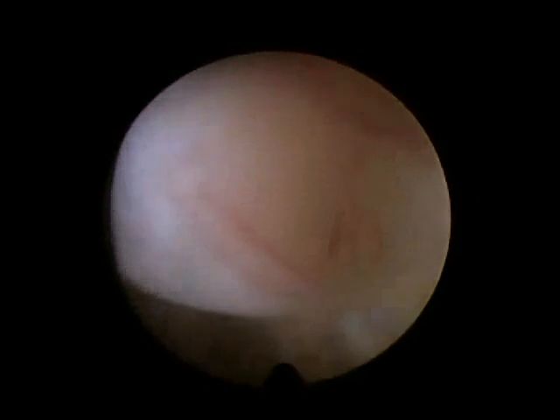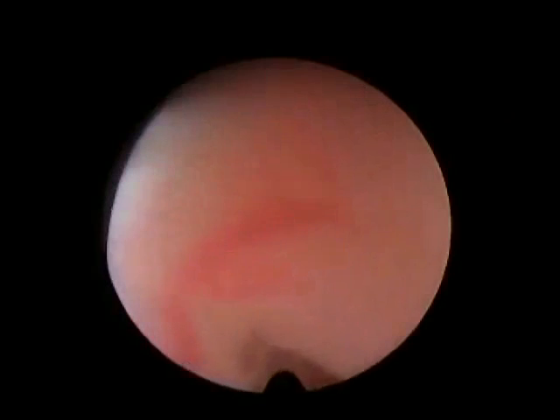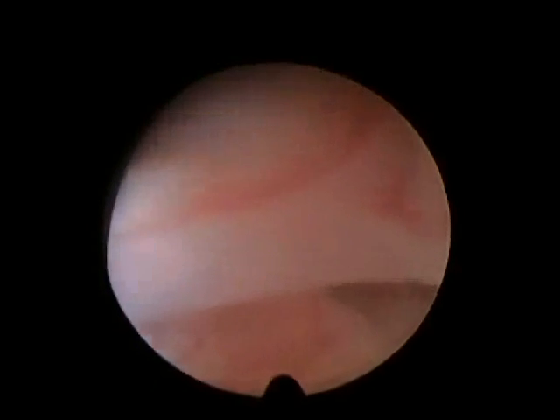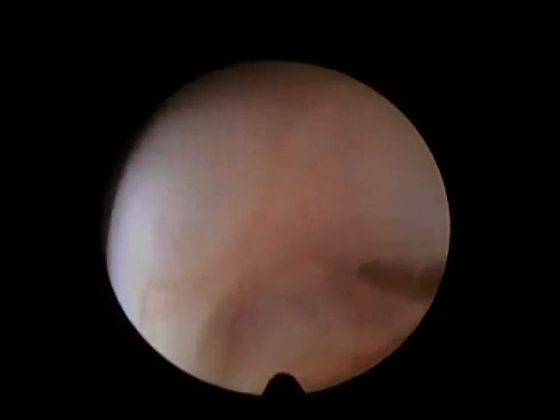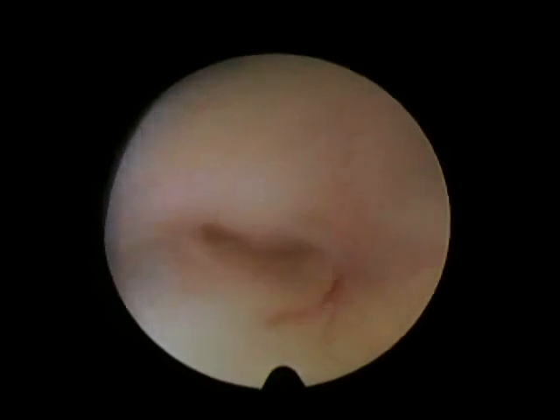It's very important. So I try to put the os at 6 so I can insert the hysteroscope. See? There we are inside the cervical canal. First vaginoscopy. It was a success. But I was out of luck. There was a cervical stenosis. I couldn't go any further.